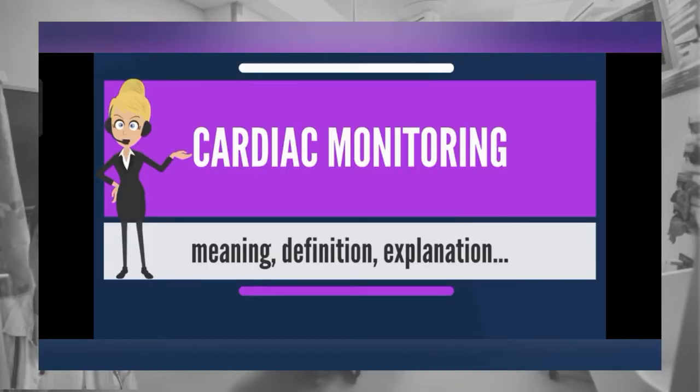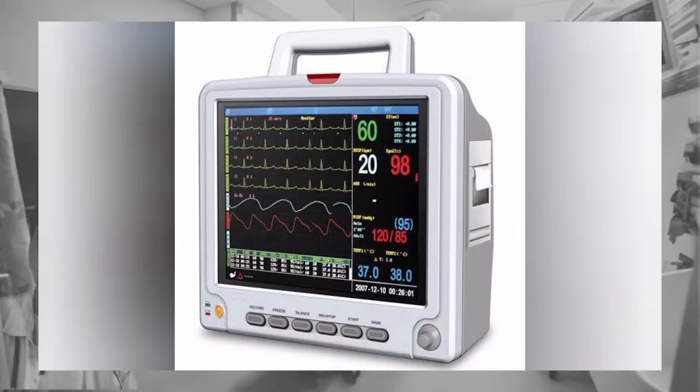What is the purpose of a cardiac monitor? The cardiac monitor continuously displays the cardiac electrocardiogram tracing. Additional monitoring components allow cardiovascular pressure and cardiac output to be monitored and displayed as required by patient diagnosis and treatment. Oxygen saturation of the arterial blood can also be monitored continuously.